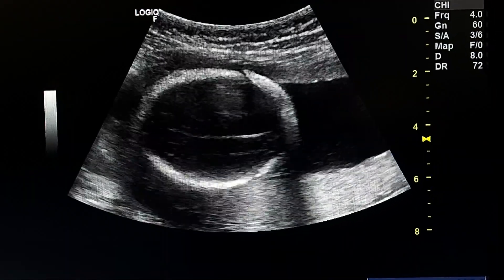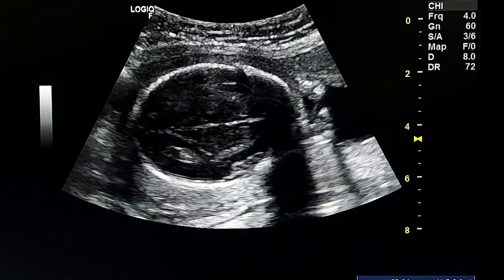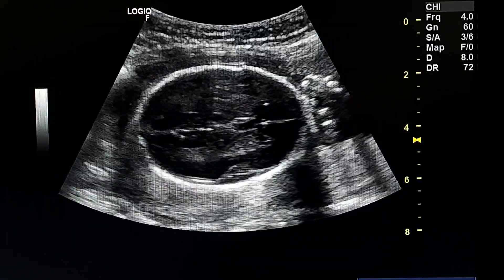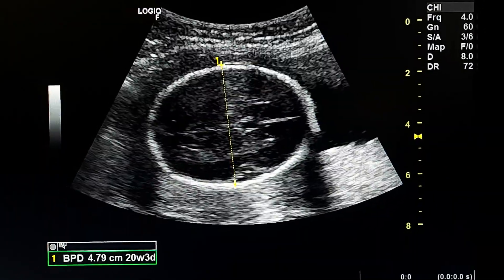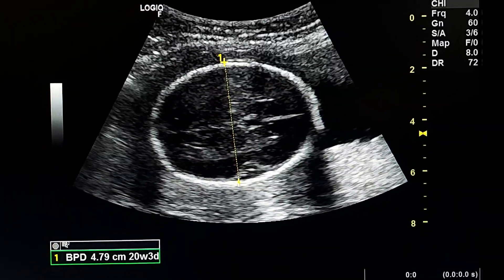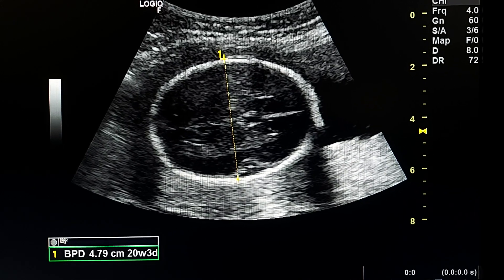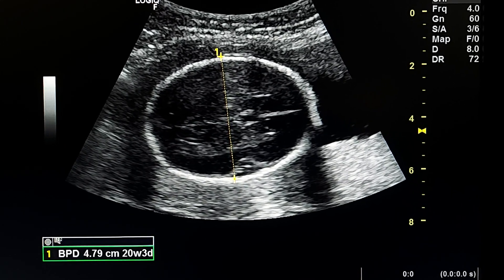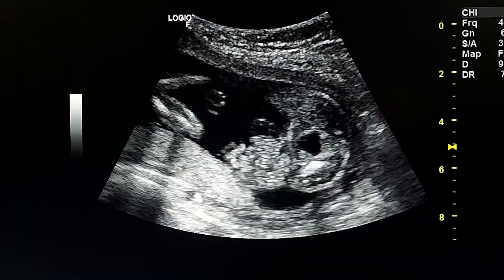This is the head, which is normal. The biparietal diameter measures 20 weeks and 3 days.